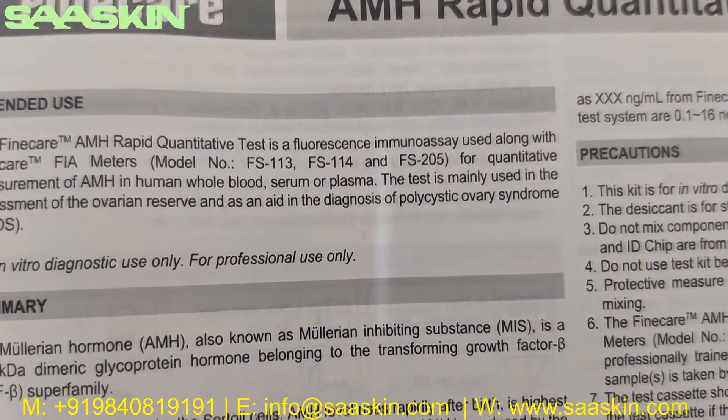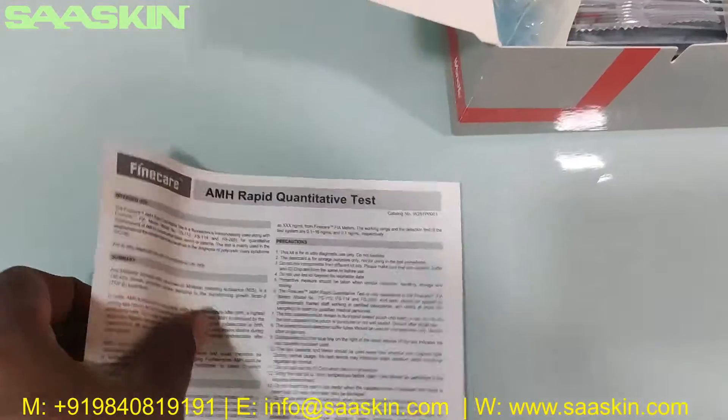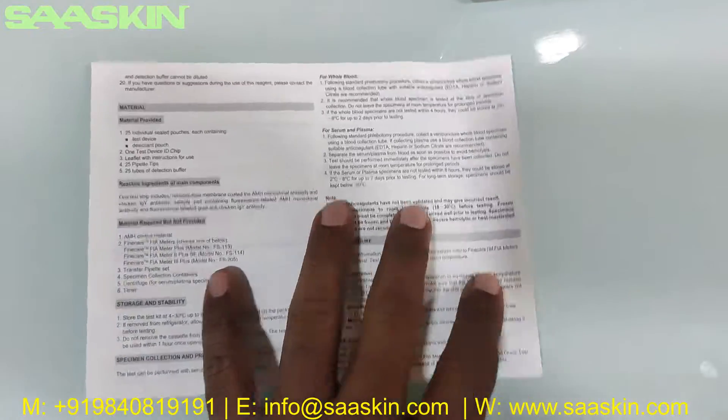The test is mainly used in the assessment of ovarian reserve and also aids in the diagnosis of polycystic ovary syndrome. This is a complete instruction for use manual which has all the details for you to conduct the test process — test preparation, procedure, conducting the test, and how to interpret your results.